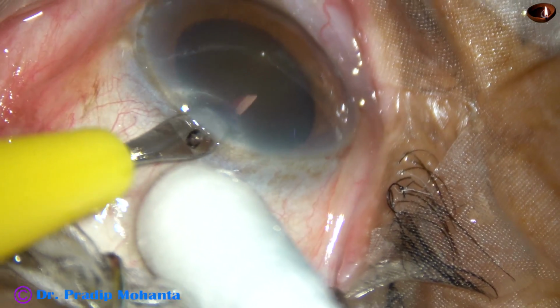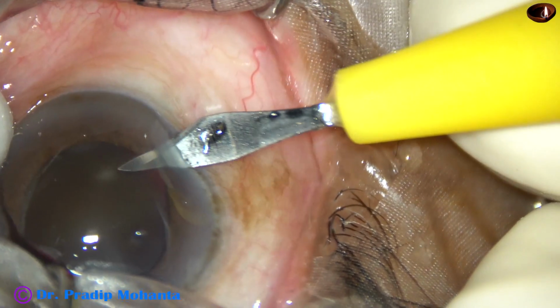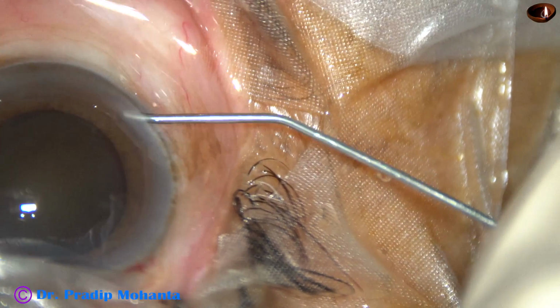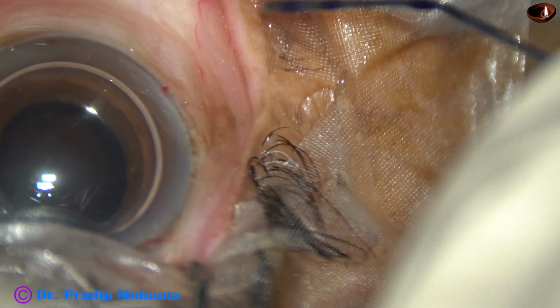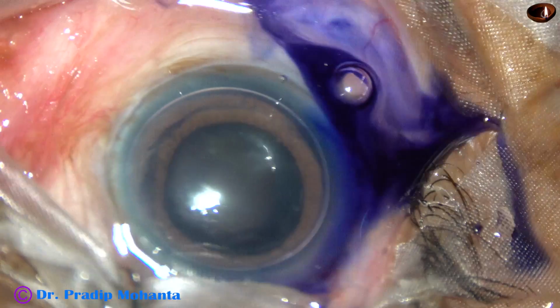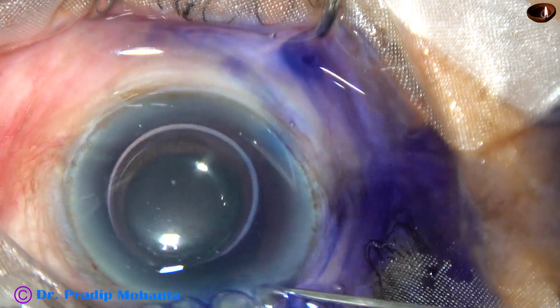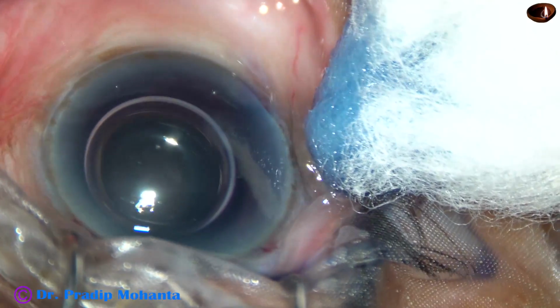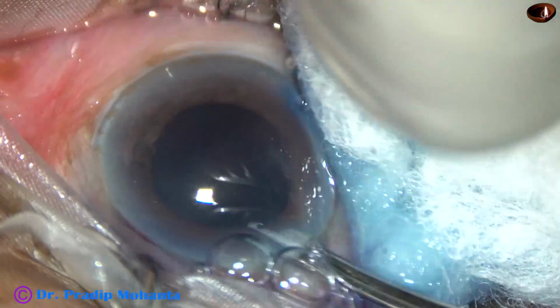By this time, the main incision has been made and two side ports on either side of the main incision, about 3 clock hours away, are made. An air bubble is injected into the anterior chamber and this is trypan blue dye to stain the anterior capsule. The idea behind using this dye is to get some contrast. Though the cataract is almost black, use of this dye will offer some contrast to the surgeon.